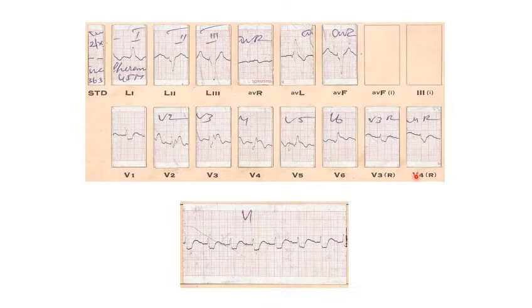But in a patient with left bundle branch block, the initial as well as the later half of the QRS complex is altered, and the initial portion can also be altered in myocardial infarction. So in a patient with LBBB, the initial part of the QRS complex can be altered both by LBBB as well as by myocardial infarction. Hence, in presence of LBBB, there is a difficulty in diagnosing previous myocardial infarction.